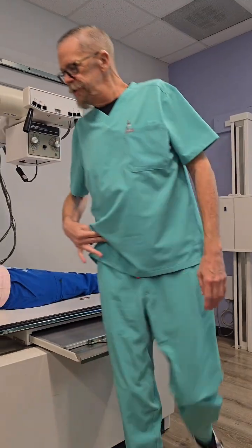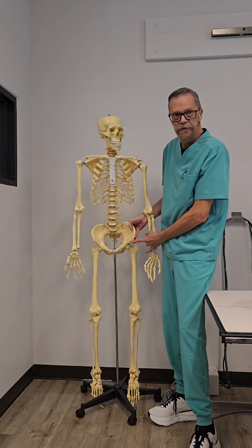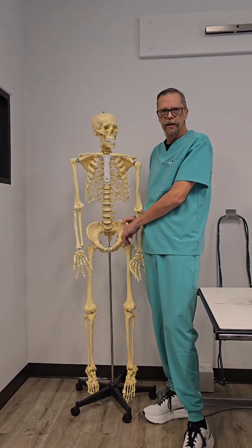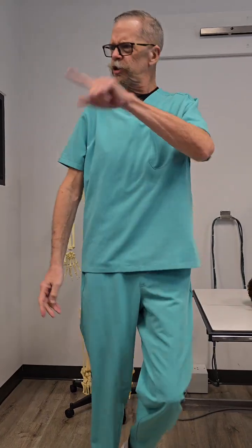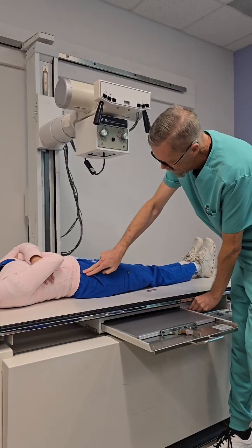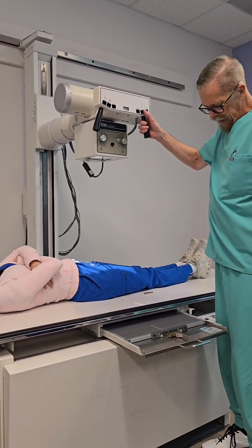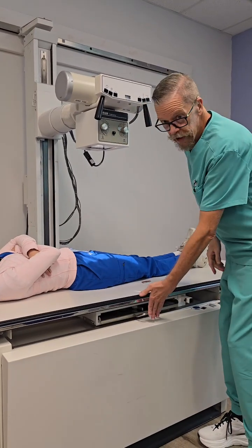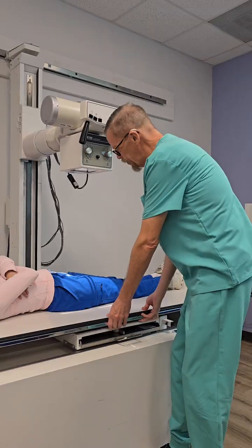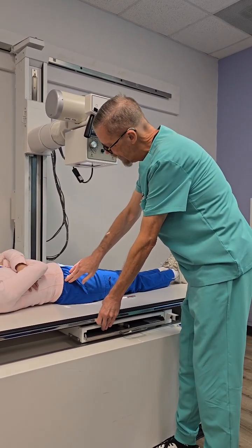That is this part right here of the pelvis, this anterior portion — the ASIS, anterior superior iliac spine. So, ASIS is right here. I have the top of my IR at the ASIS, if not a little above it. And that's making sure I'm lined up. ASIS is right here.